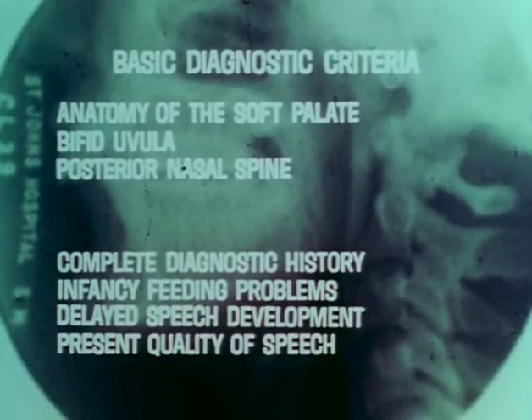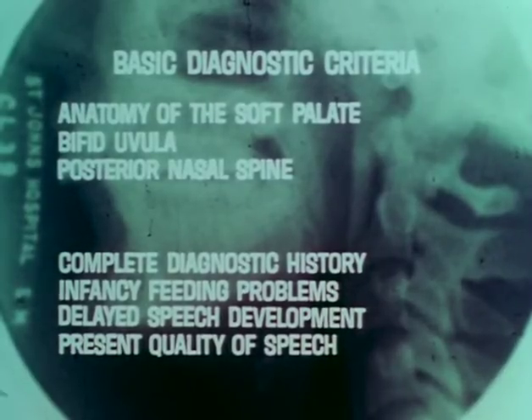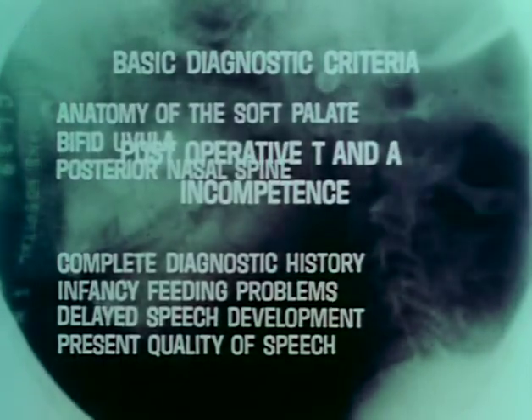A radiological examination to include cinefluorographic studies during deglutition and phonation in preoperative evaluation of suspicious cases will serve to avoid a speech disaster and medical legal challenge. Three types of patients will be compared: postoperative T&A incompetence, cleft palate incompetence, and submucous cleft palate incompetence.